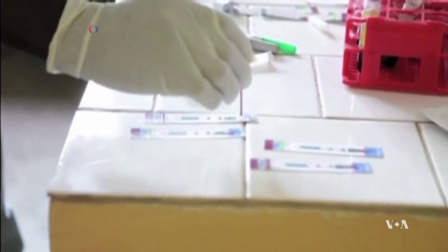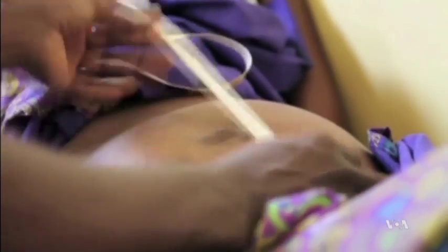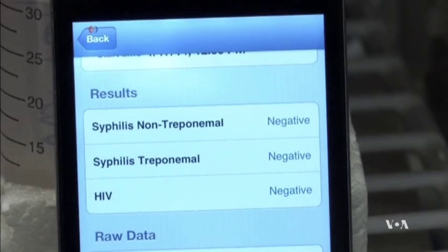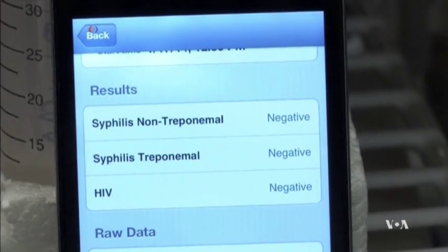Sensitivity in finding the target antibodies was 92 to 100%, while ruling out the people not infected was 79 to 100% on the target. Sia says the capabilities of the lab-on-the-chip attachments are not limited to sexually transmitted diseases or STDs such as HIV and syphilis. We can certainly look at other STDs such as hepatitis and herpes and so forth, as well as other infectious diseases, including malaria and so forth, but also chronic diseases.